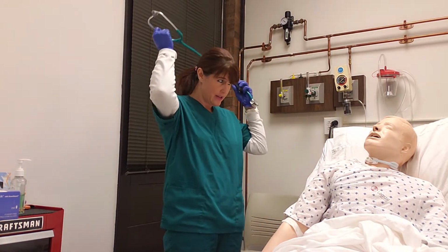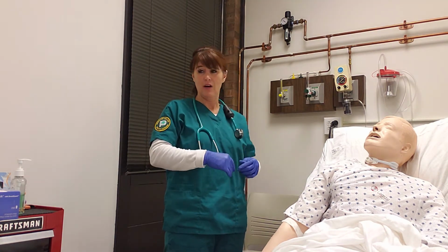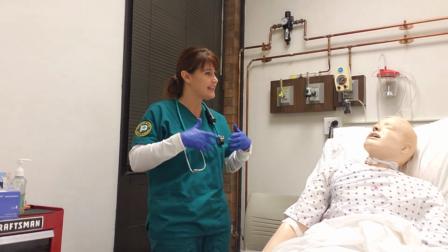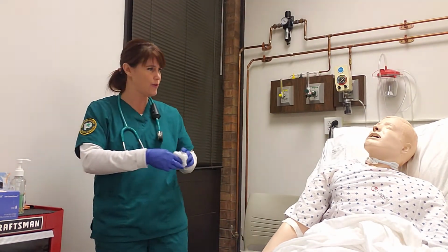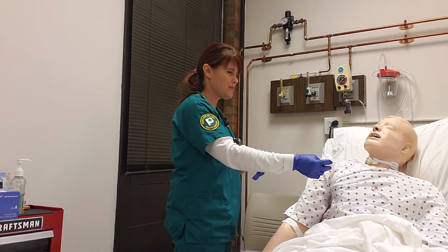Do you remember how to do the huff cough? That's to get those secretions moving up. Why don't you see if you can get some of that out of there for me? All right, just give me a good cough and spit it out.